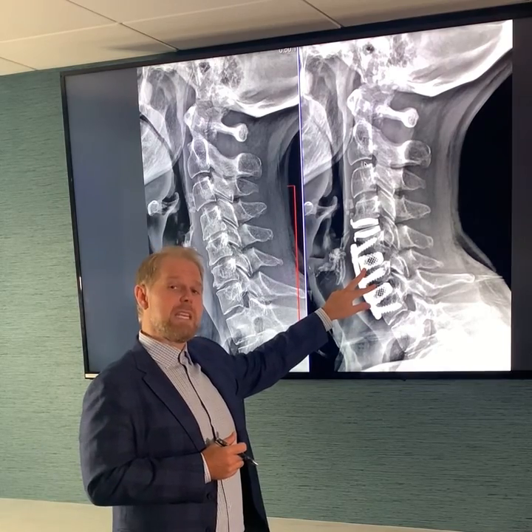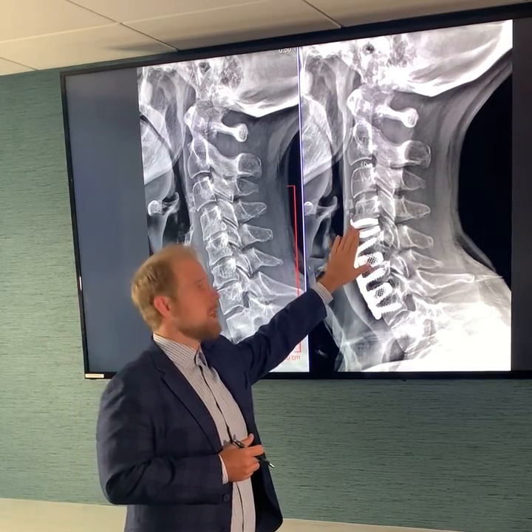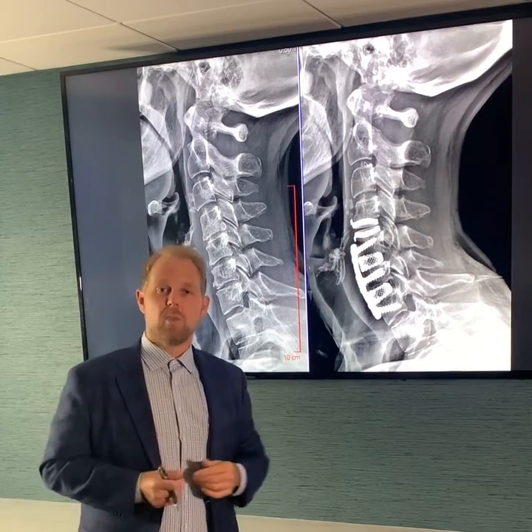By fusing the two that need it and replacing the one above, we keep better motion and we can protect the rest of the spine as the patient lives their life.